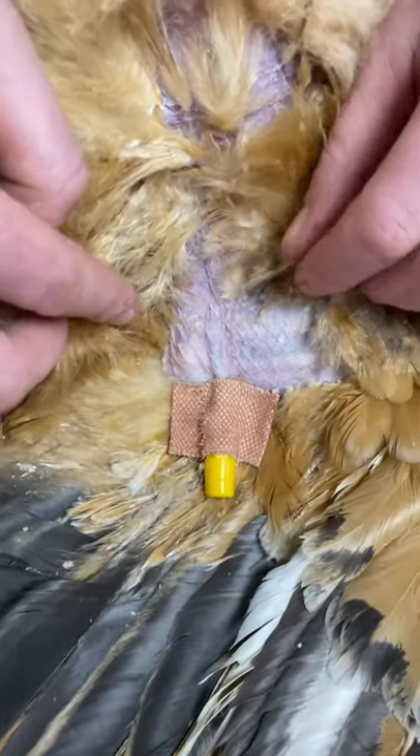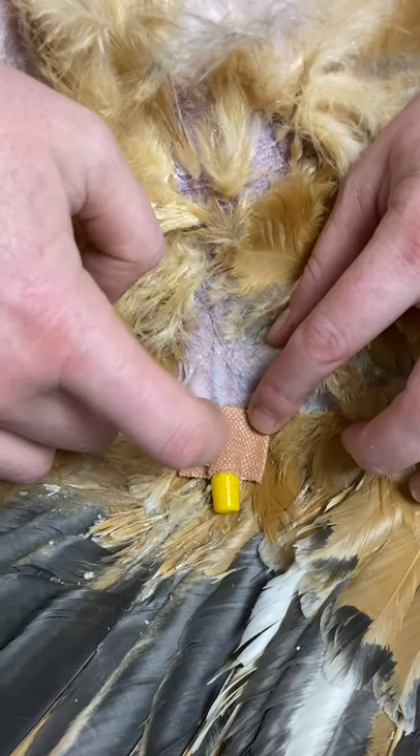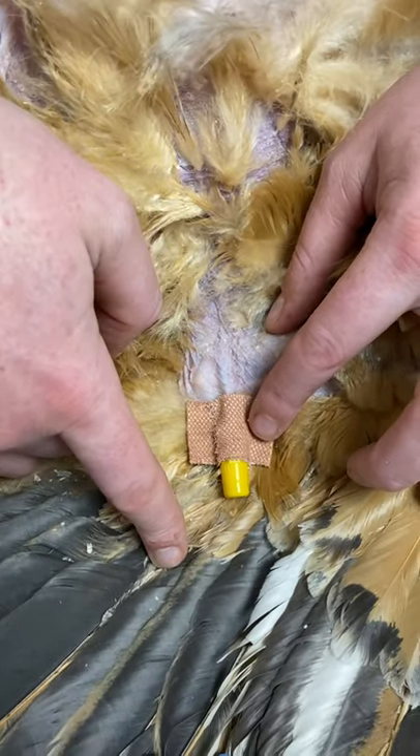The next thing we're going to do is put a suture here through the skin, a suture here through the skin, and a suture around the base of the bung around one of these primary feathers to hold it in place.